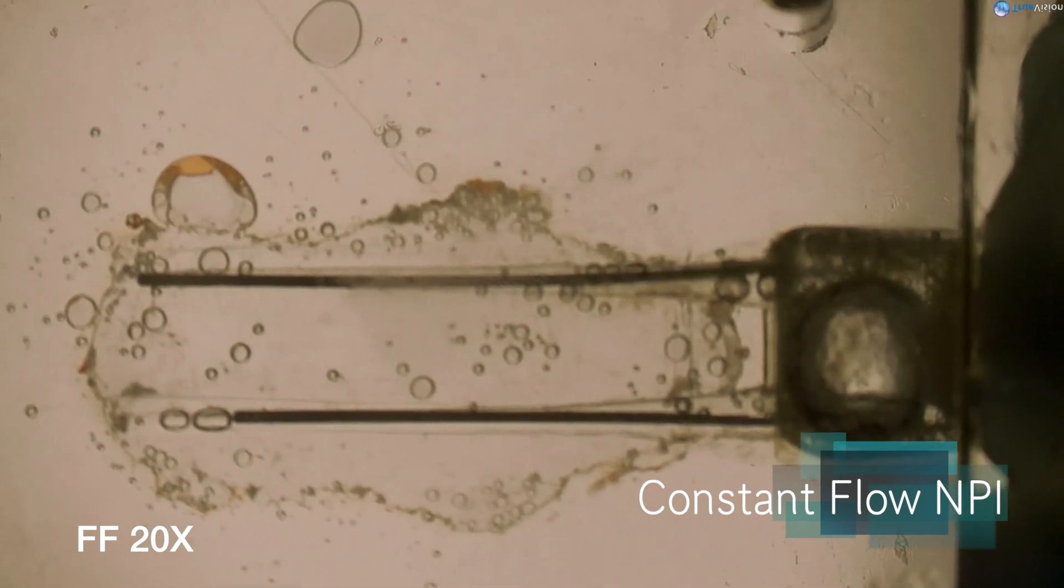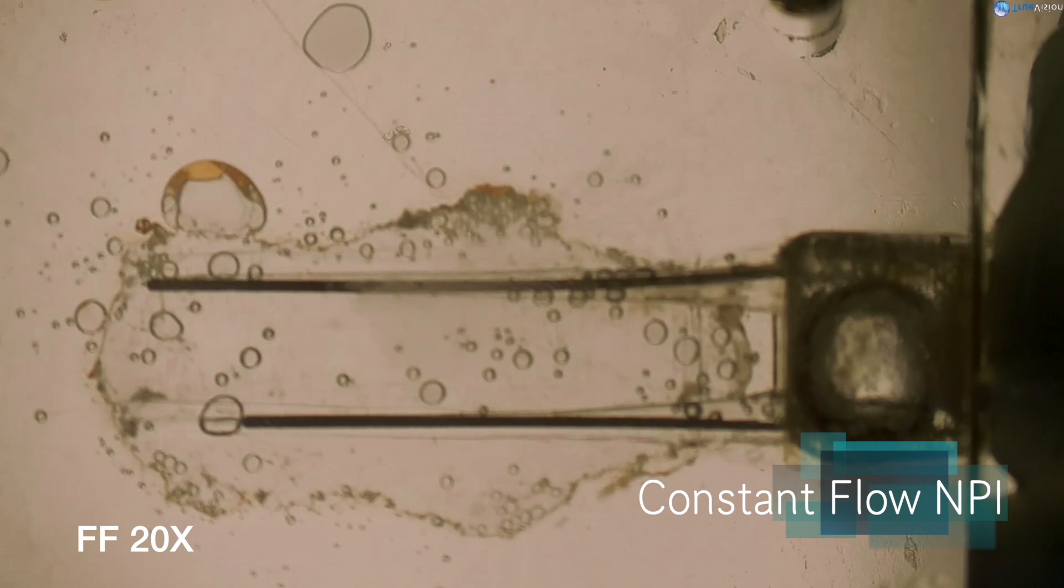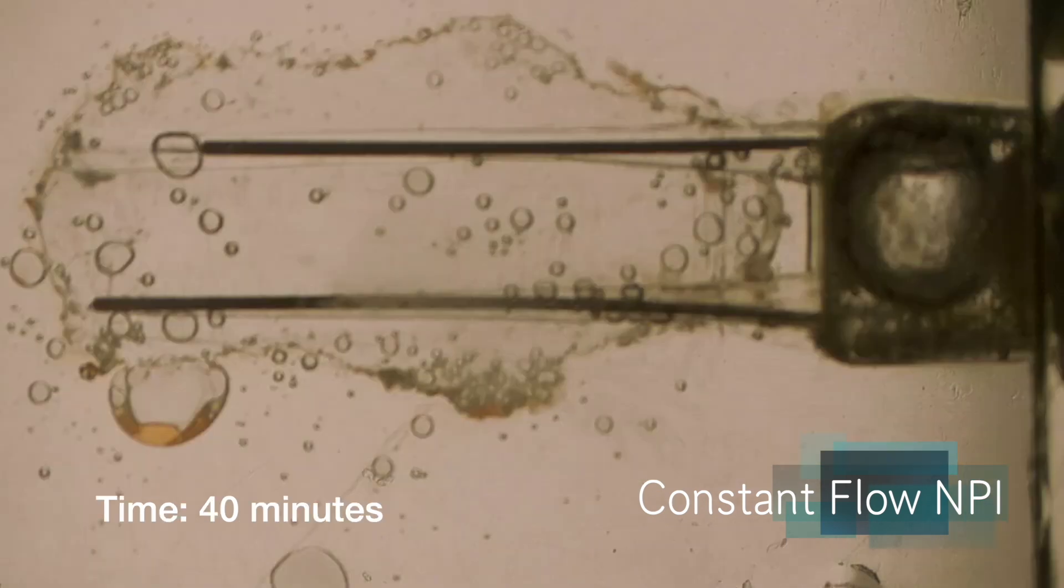All right, we're just about finished. I want to take that last little bit right at the end there. And it's done. It took 40 minutes.